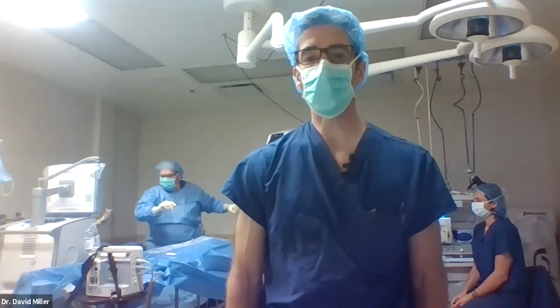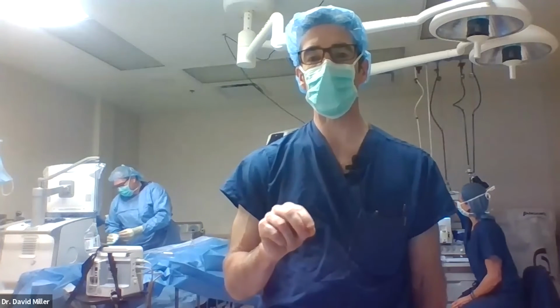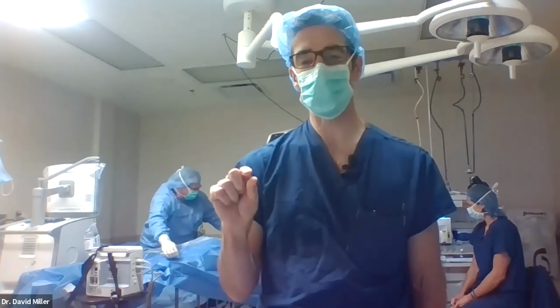Do you aspirate the subretinal fluid? Yes, we did. Once we made the retinal hole, the retinotomy site, we did use active aspiration. It's hooked up to the vitrectomy machine. It's a soft silicone tip on there, but I'm using very little aspiration, probably at the most a quarter of the petal being depressed.